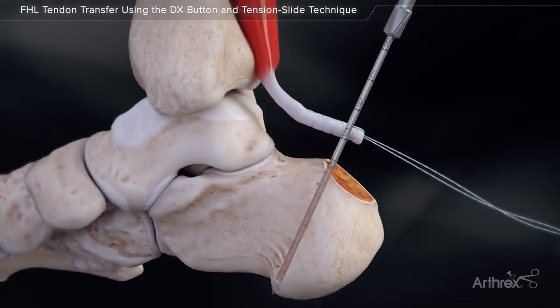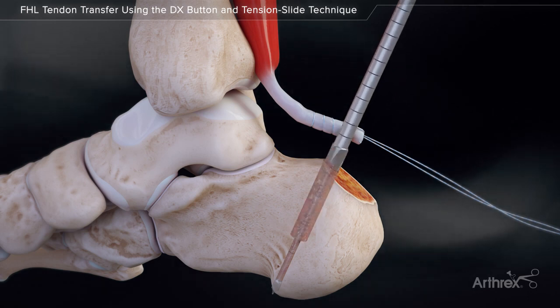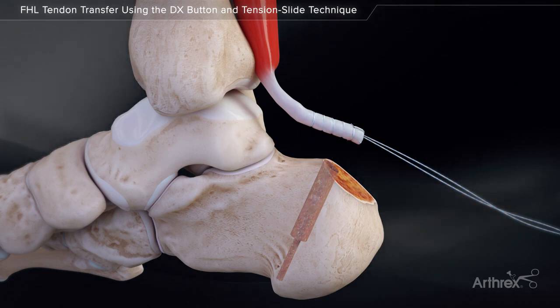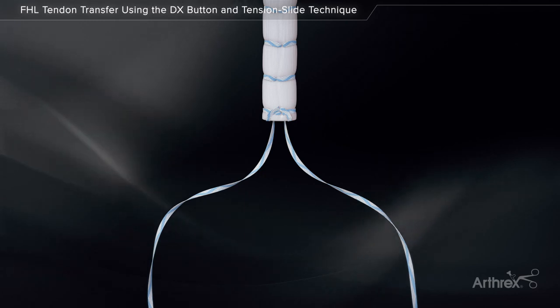Use the reamer in the implant system. Drill either 20 or 30 mm based on screw length. Note, when reaming over the 3.2 mm spade tip pin, make sure the pin does not push through the plantar fascia and skin. Remove the spade tip drill pin. Irrigate to remove bone debris. Remove the traction stitch and any tendon past the second mark.